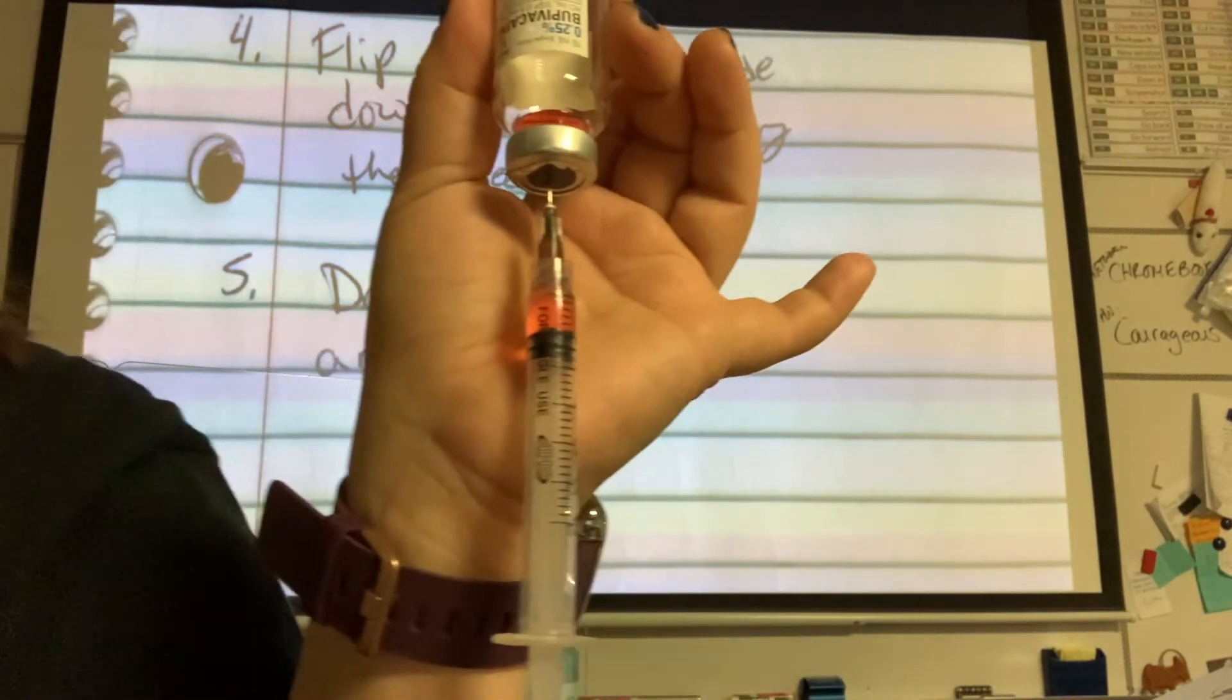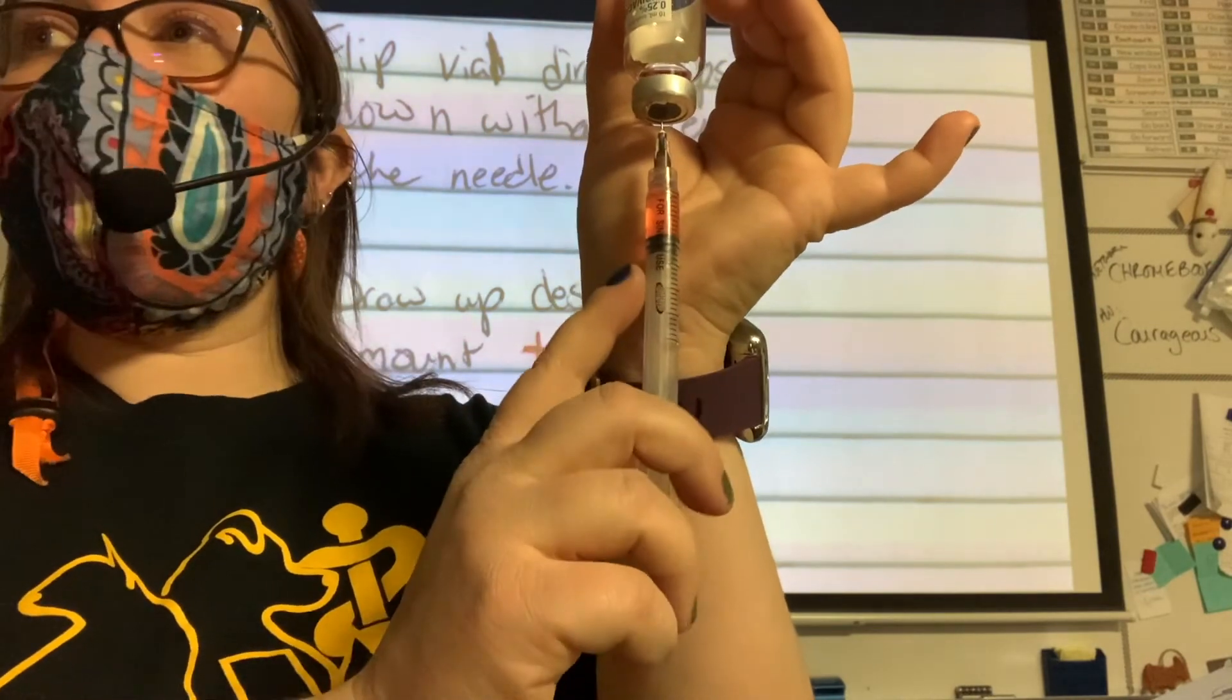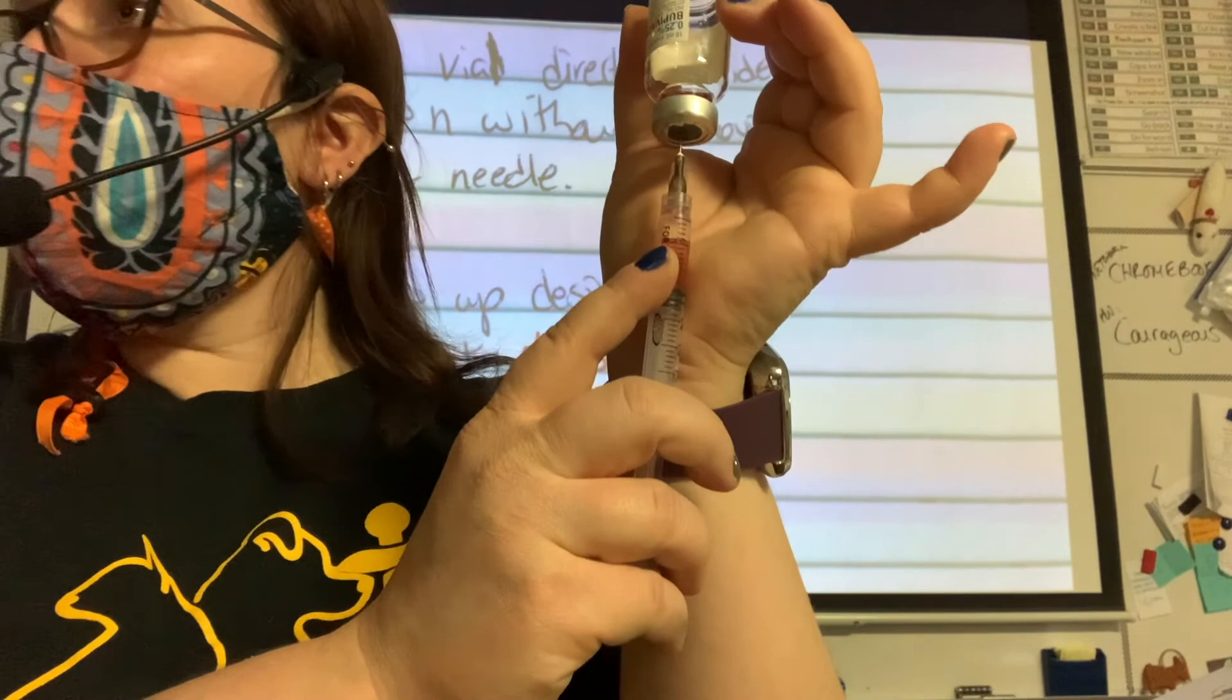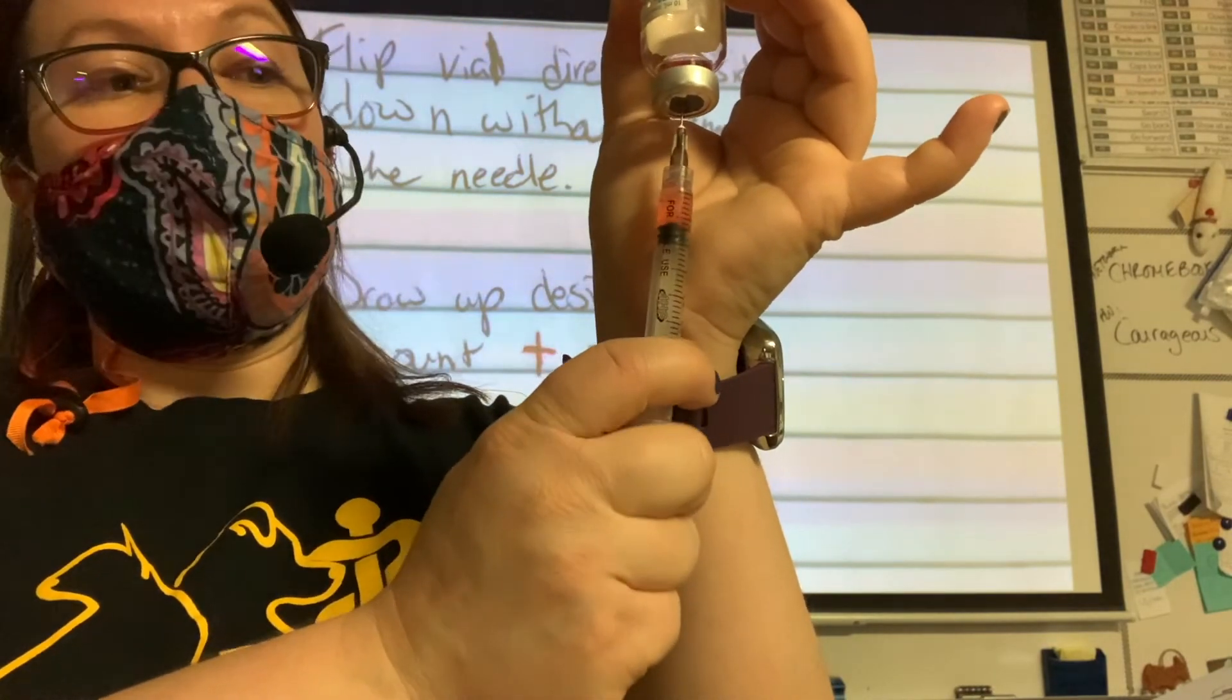So now I flicked, I got my air bubbles out. So I drew up more than I needed just to make sure I could get my air bubbles out. Also aside from flicking, what you can do, think about when you have a straw or like you have that ice cube that stuck. Like you flick at it really hard, but then you can also use the straw to get at it or the slushie that has like the ice on the sides of the cup. So if you shake it, how many of you guys will do that with your slushie to like tap it all to the bottom. So that's kind of what I'm going to do here. So what I can do is I can pull really fast. And if you see that it causes that like flow, I increase the pressure. So it's going to move the air on the side of the walls. And if I push it up really fast, it should jostle. So I can kind of shake if the tapping isn't working or if I have that bubble that just refuses to move. Cool beans?